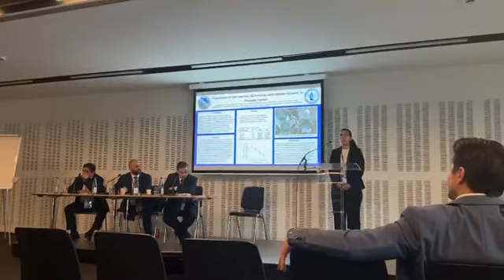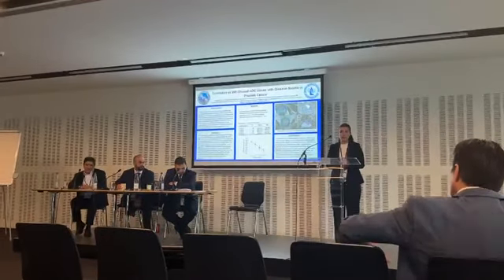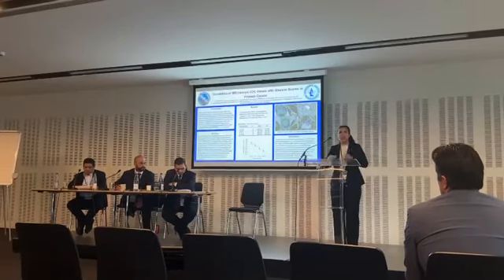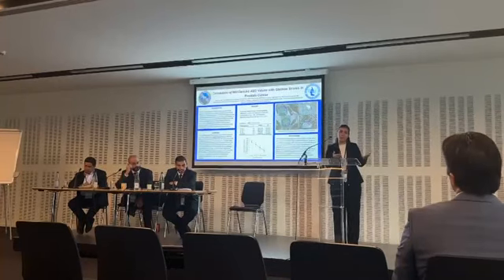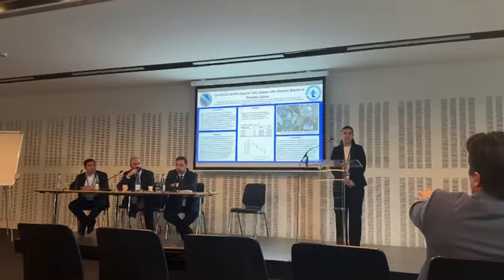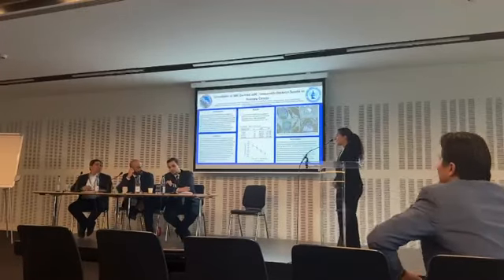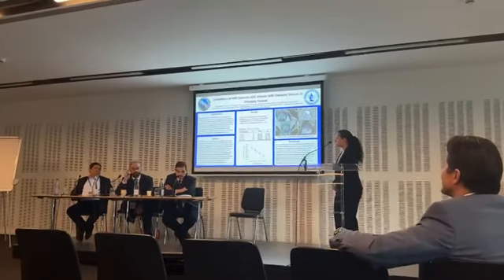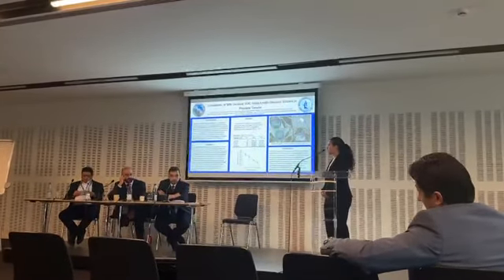I believe that's also part of the reason why ADC values aren't so well known and aren't a standard of care to use, because it's hard to compare one ADC value to another, since MRIs are so different. But we have the protocol, at least in the future. I also think the study is an eye-opener for the correlation itself, regardless of the numbers: that low ADC correlates with a higher Gleason score. So I think this would lead to further studies from different institutions.